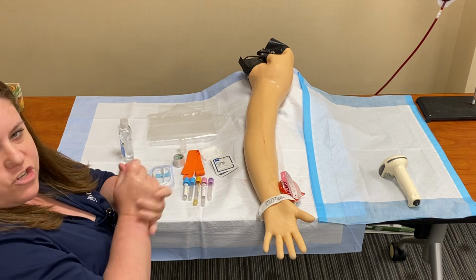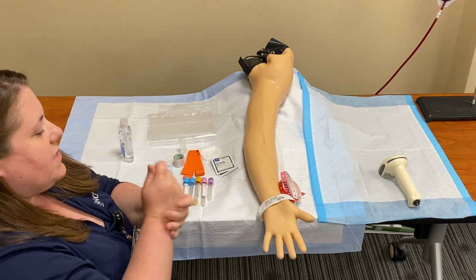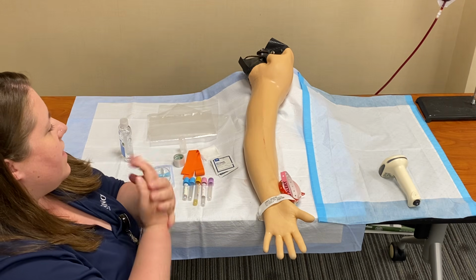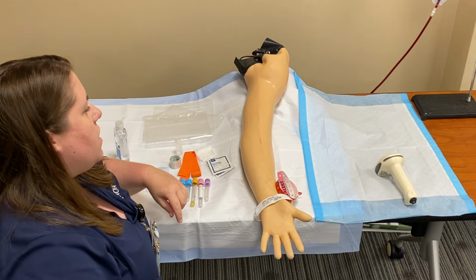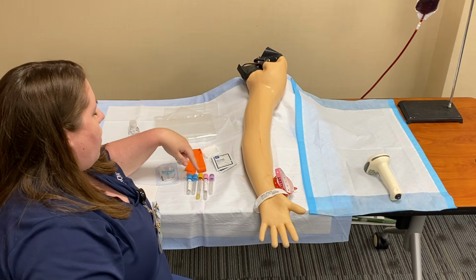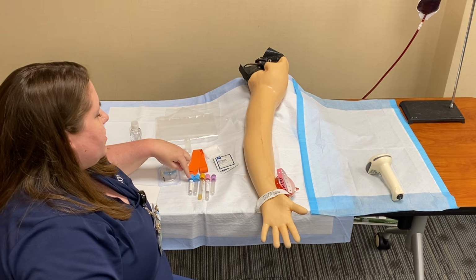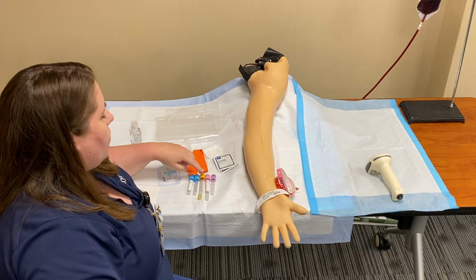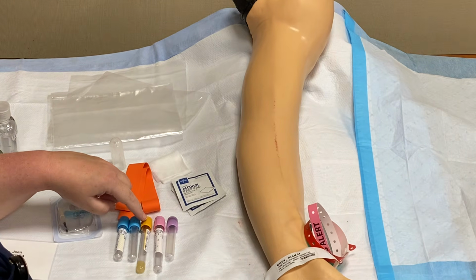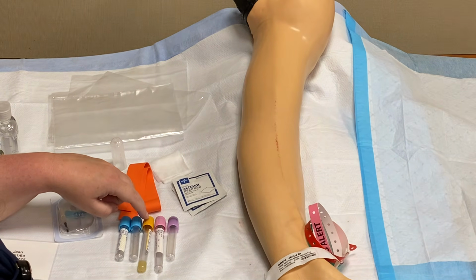My patient said, sure, it's a good time, but she wants to know what tests I'm running. So I wanna make sure I can explain all of my tests to her in a way that she understands. So I'm gonna let her know we're drawing a PT, which is to check for coagulation or how quickly her blood clots. We're also drawing a BMP, which is a metabolic test, or to test her electrolytes and her chemistries.